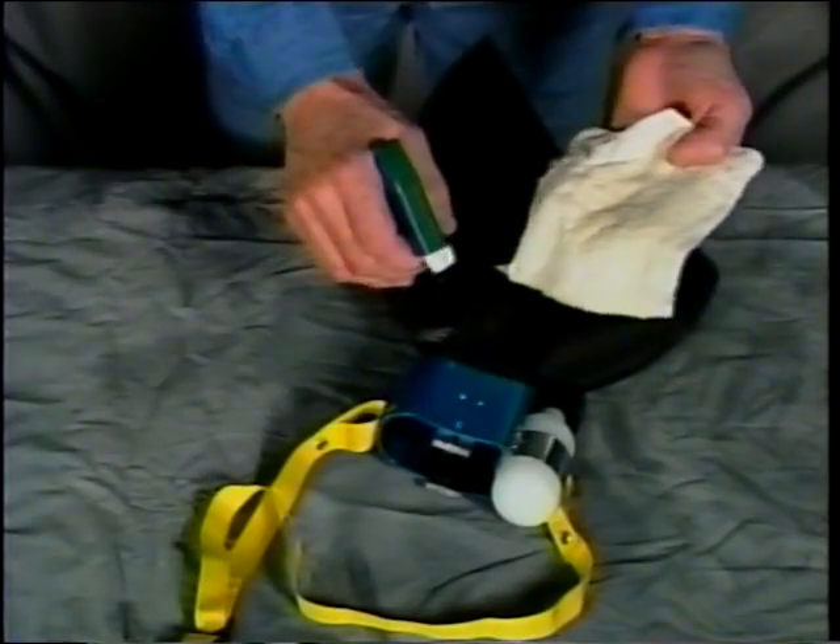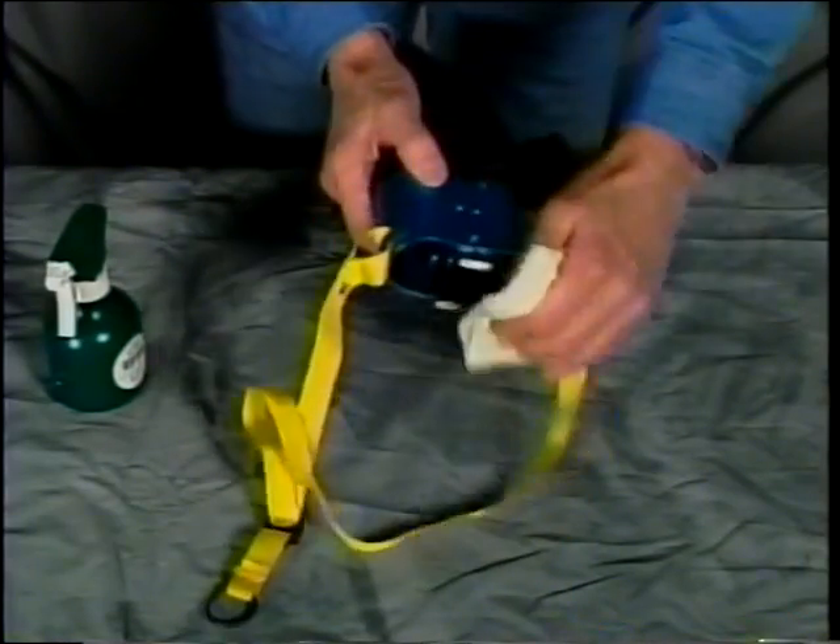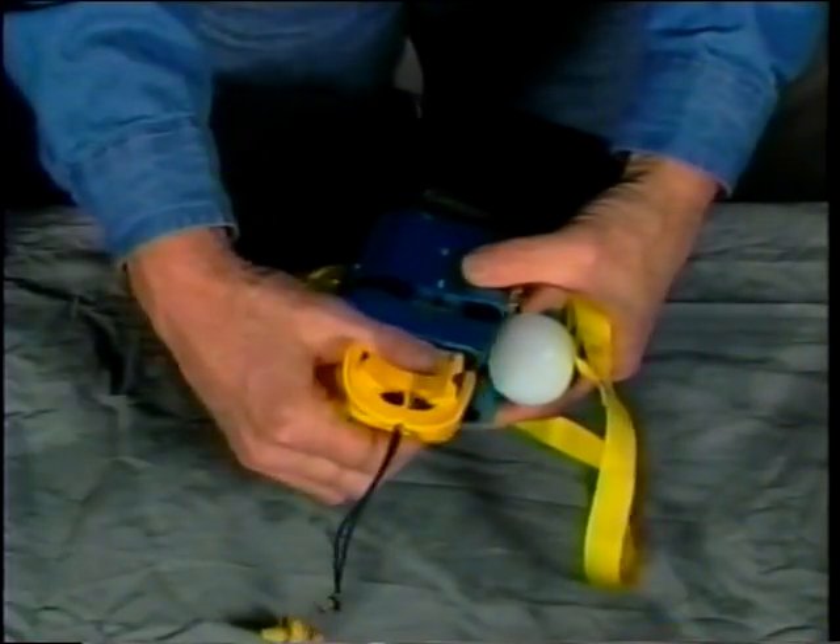The surfaces of the used training unit should be wiped down with a disinfectant. Attach a clean mouthpiece to the training unit.